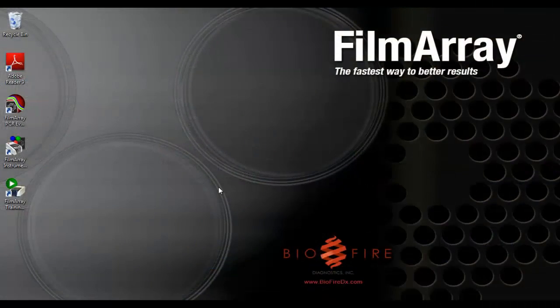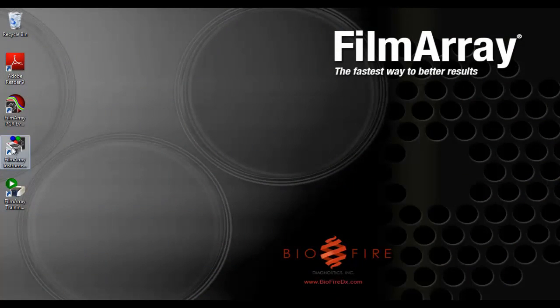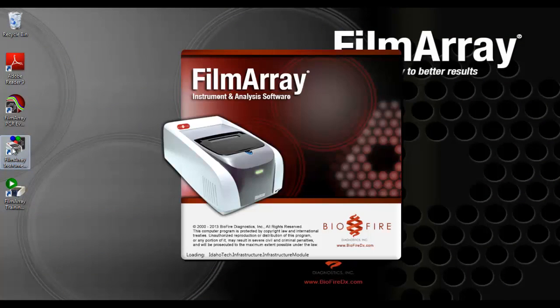Now open the FilmArray instrument control software if it is not already open. You will need to double click on the desktop icon.